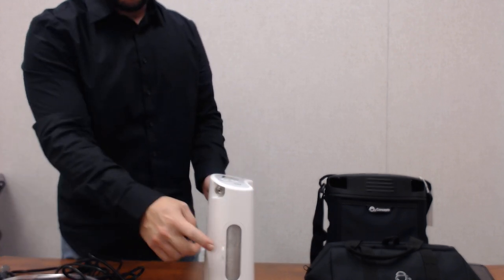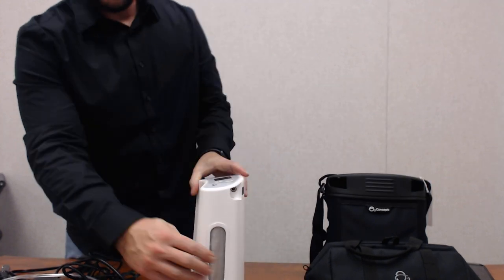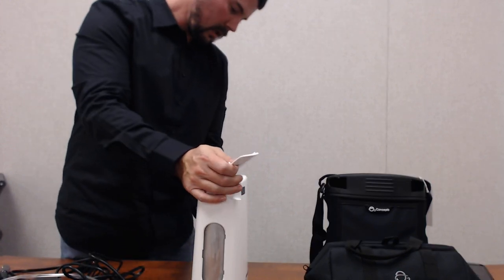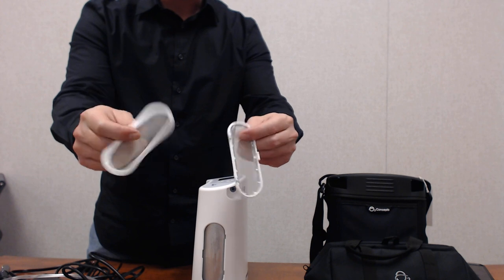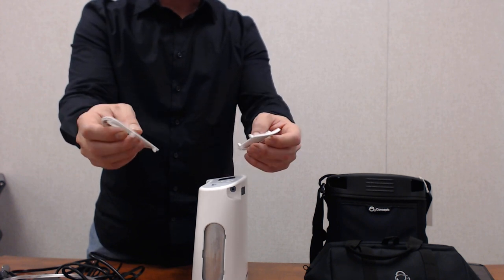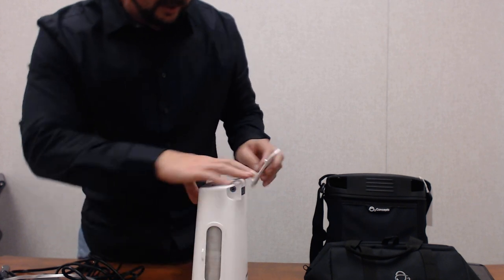On the side of the device we have our filters — one on each side. These covers come off to access the filters. They should be cleaned at least once a week. You can use regular water and some soap, rinse them off, pat them dry, and then connect them back to the device.